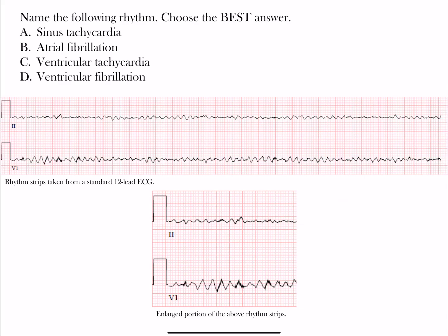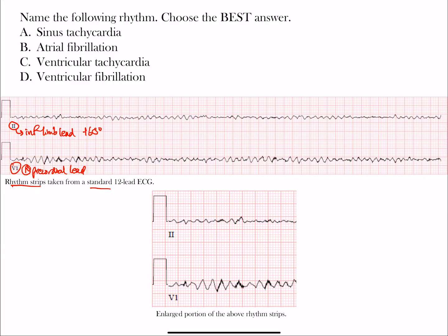Hopefully you had a chance to go through this and choose your best choice. So let's look at what we have here. We have lead II, which is an inferior limb lead sitting at positive 60 degrees, and lead V1, which is a right precordial lead. These two rhythm strips are taken from a standard 12-lead ECG. Down here I'm showing you the same leads enlarged so you can see the small boxes, which may help with determining rate or looking for different intervals.